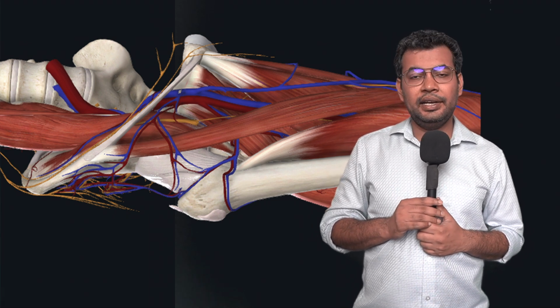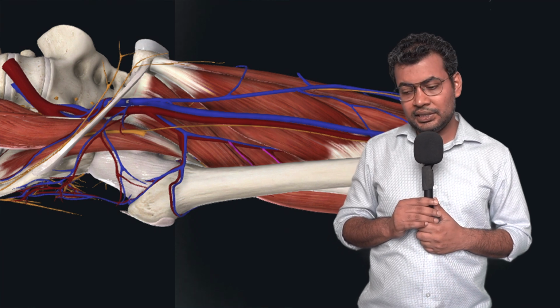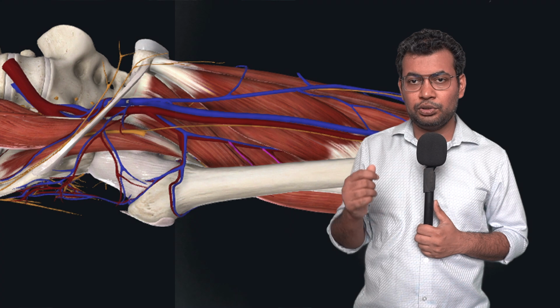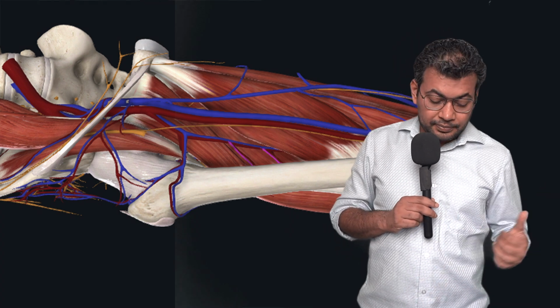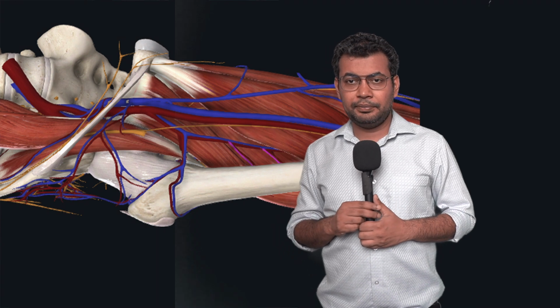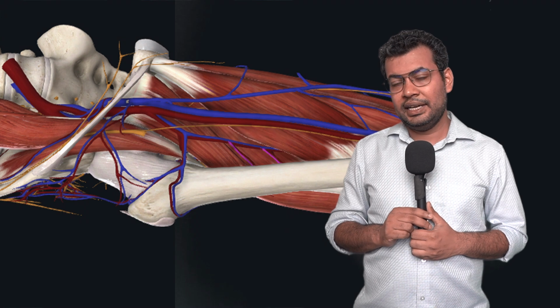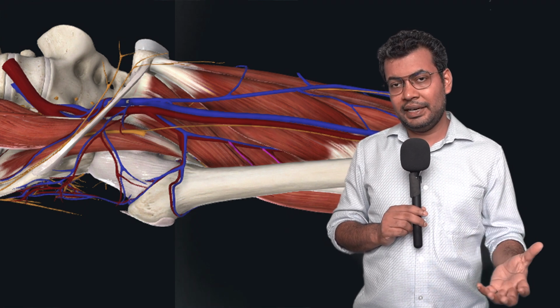Then the iliopsoas muscle is attached at the lesser trochanter. We have to cut the iliopsoas. Before cutting the iliopsoas, we tie it with an Ethibond suture, so that later on we can attach it to the megaprosthesis. So this way we detach all the muscles, and then we get the tumor specimen outside.